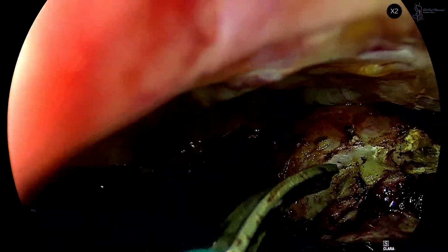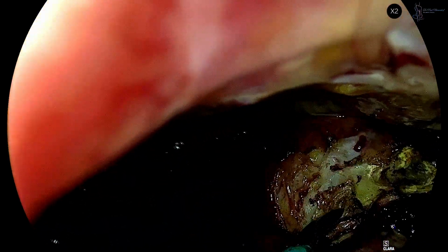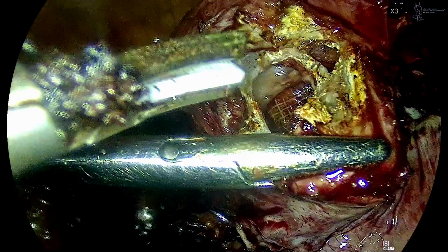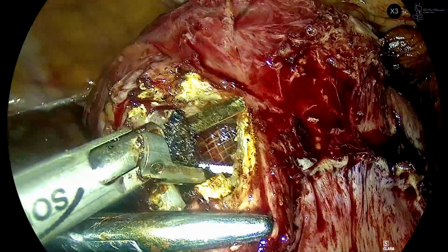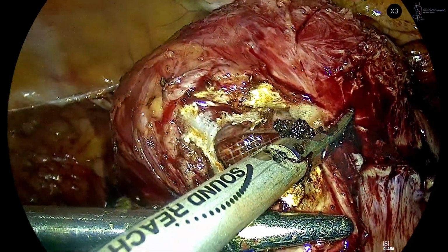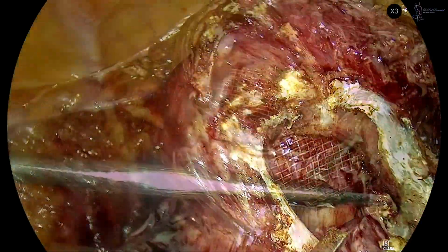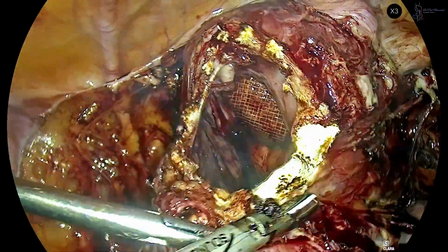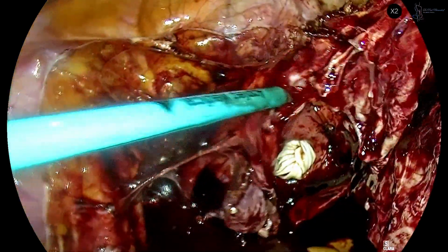Colpotomy is performed using a harmonic scalpel, an advanced ultrasonic energy device that enables precise cutting and coagulation while minimizing thermal damage to surrounding tissues. The harmonic scalpel facilitates precise tissue dissection while simultaneously sealing small blood vessels, reducing the risk of excessive bleeding and improving hemostasis.